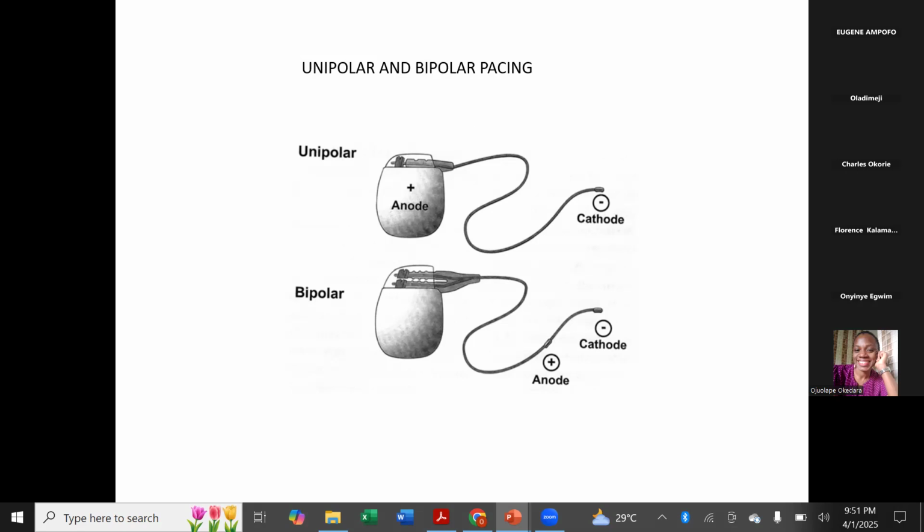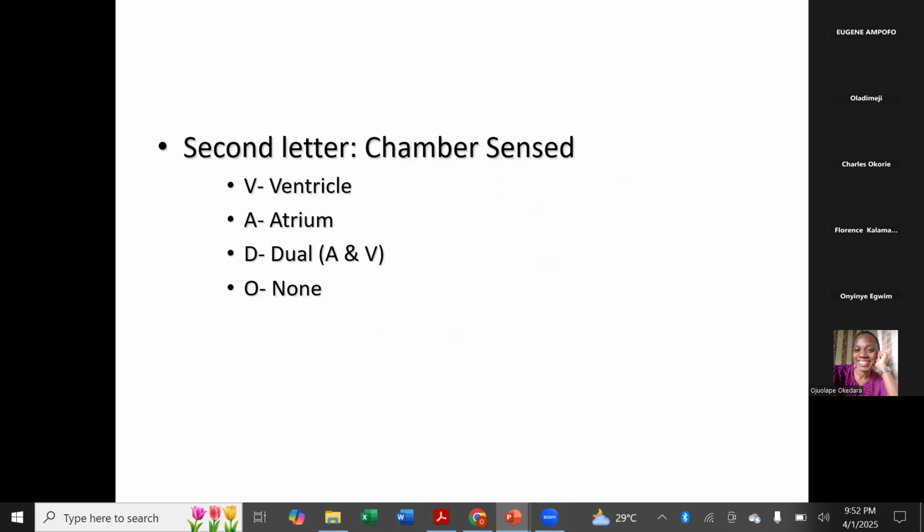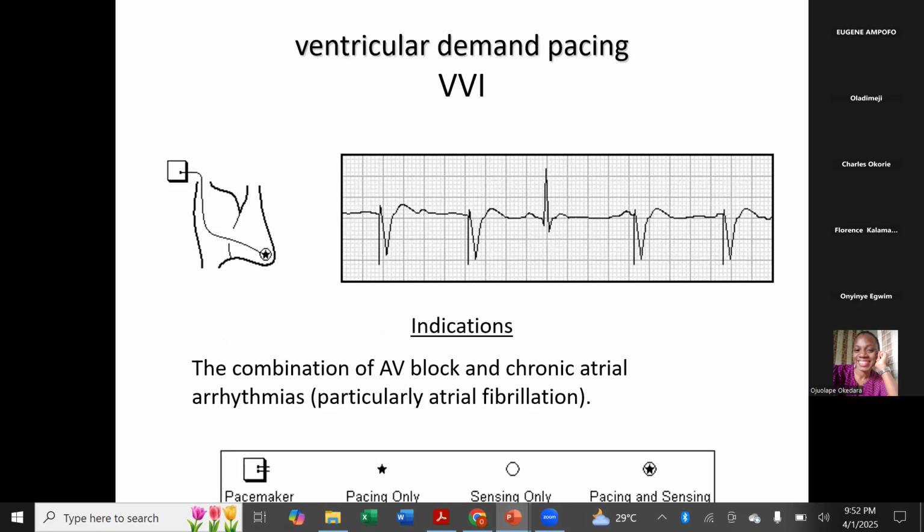Hope we get that. So that when you see a patient in clinic and you're not seeing the pacemaker spike, don't say that there's no pacemaker spike, so it does not have a pacemaker. No, it might have a pacemaker because the circuit is very short if it's bipolar. But if you tell them to switch the patient to unipolar, which they can do on programming, the spike will come out very broad, very visible. Is that clear? Okay. Do we have any questions?